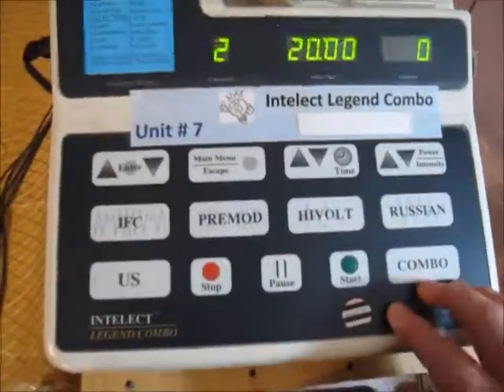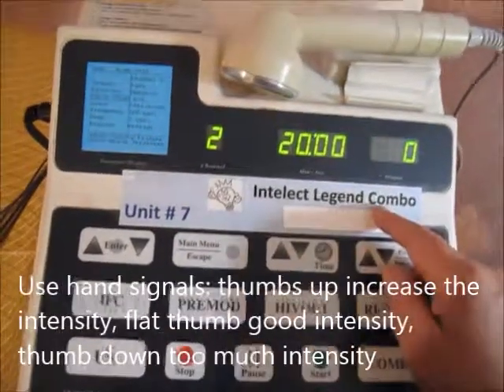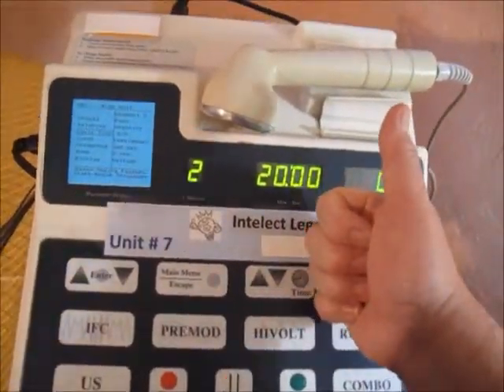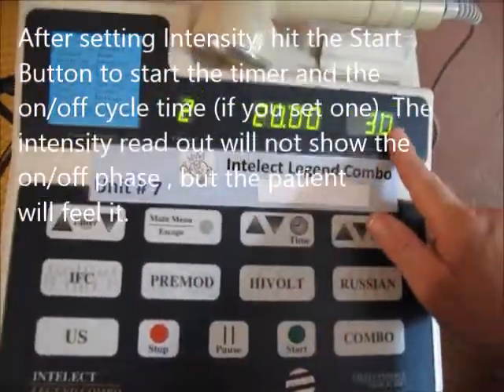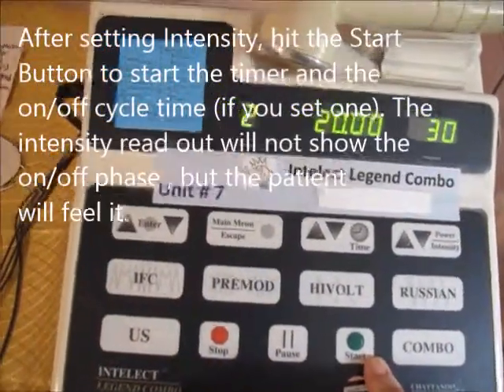Then to actually start the treatment, what you're going to be doing is increasing the intensity over here with this up arrow. You're going to ask the patients, is it good? Stop. Is it bad? So that's how I tell them to do it, because they're laying face down. After setting your intensity, hit the start button to start the timer and to turn on the on-off phases of the cycle time. The patient will feel the difference, but you will not see a difference over in the intensity box on this particular unit.